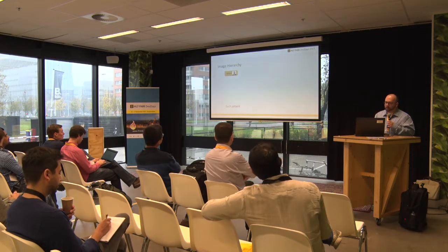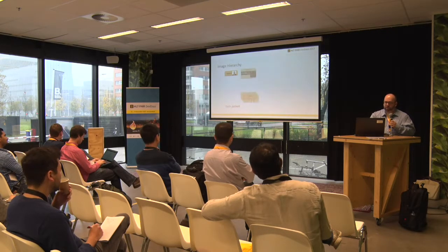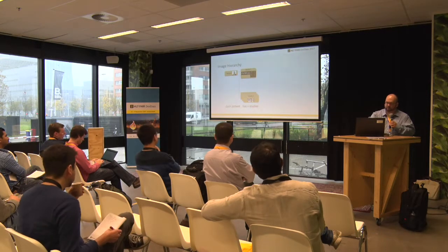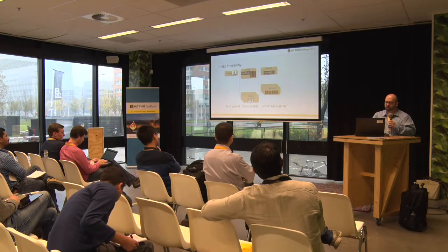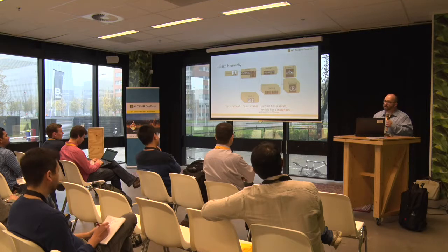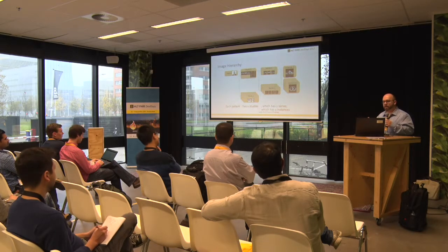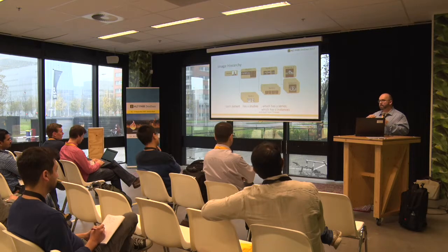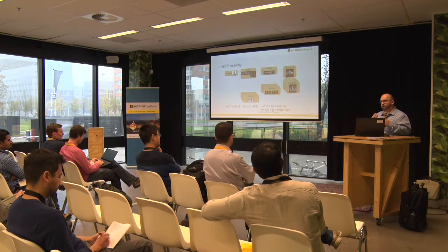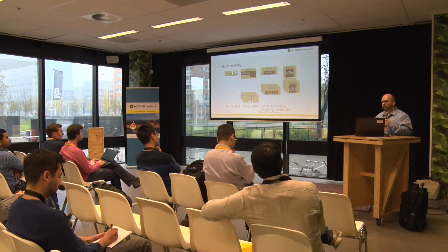So when we look at DICOM, there is a hierarchy of images. We've got a patient who contains a number of studies, and each of these studies can contain a number of series, and each of these series can contain a number of instances. So you think about an X-ray, you might take two views of a person, from the front and from the side. That would be two different series of an X-ray. A CT study would be maybe with and without contrast, 100 images. You might have a series with contrast of 100 images, and then another series with 100 images without contrast. And that would comprise a study.